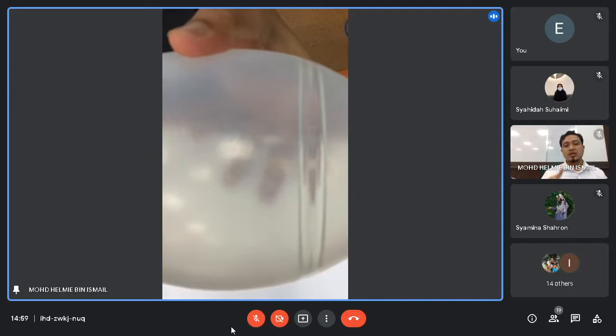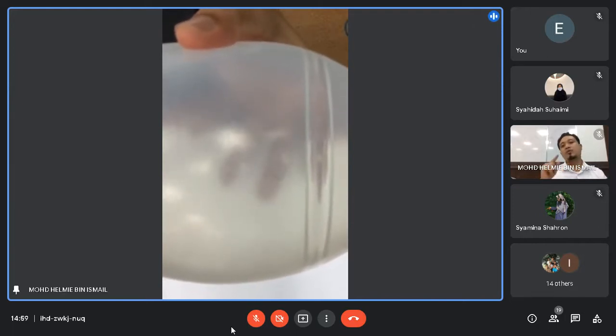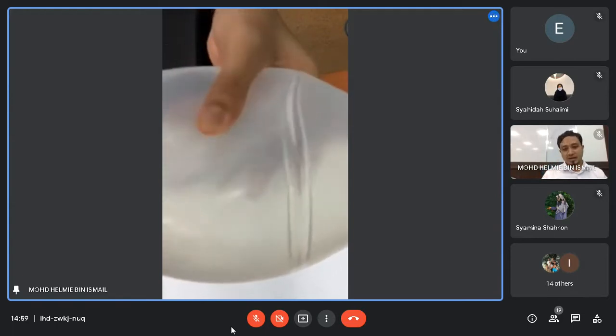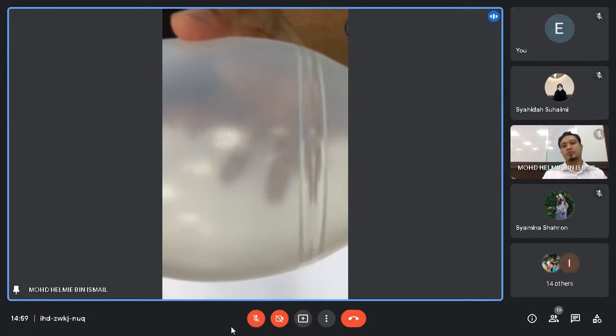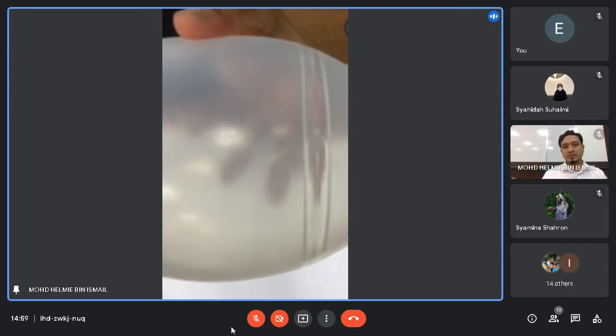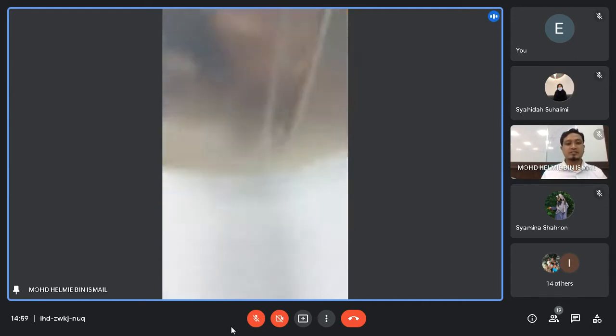You count 1001, 1002, 1003, 1004, 1005 and bag, and then 1001, 1002, 1003, 1004, 1005 and bag, in order to prevent hyperventilation. Alright?